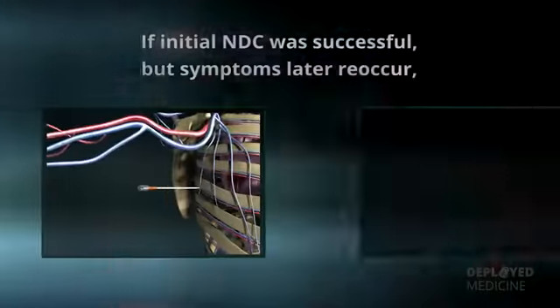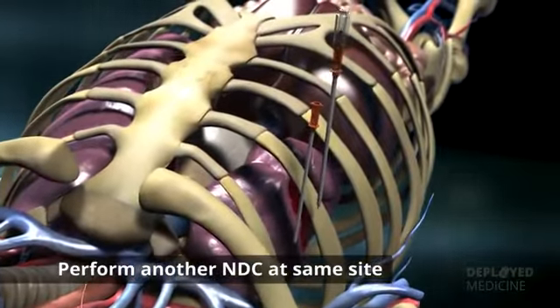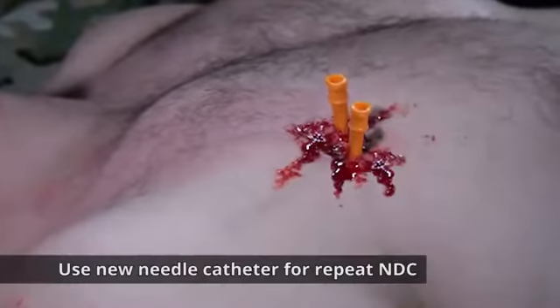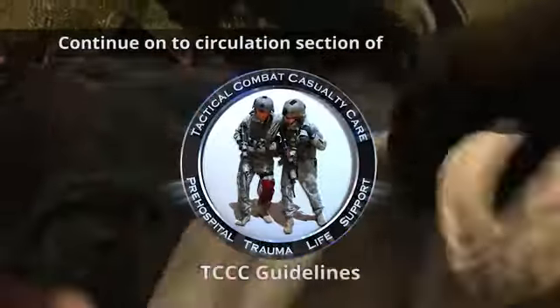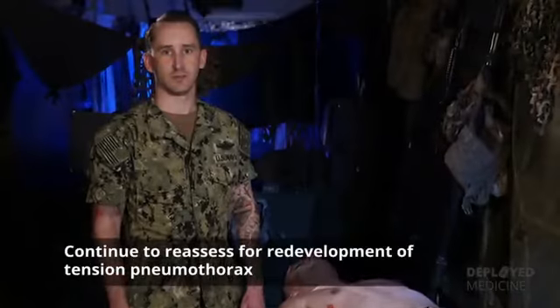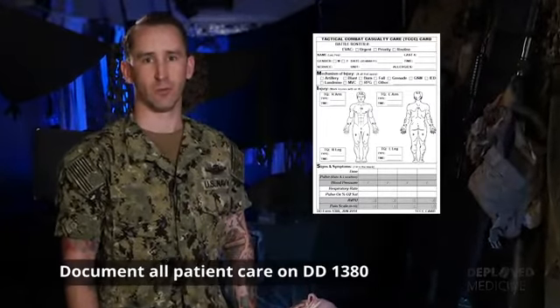be needed. If the initial NDC was successful but symptoms later recur, perform another NDC at the same site that was used previously. Use a new needle catheter unit for the repeat NDC. If the second NDC is also not successful, continue on to the circulation section of the Tactical Combat Casualty Care TCCC guidelines. Continue to reassess for redevelopment of a tension pneumothorax, monitor SpO2, and document all care on the DD Form 1380.